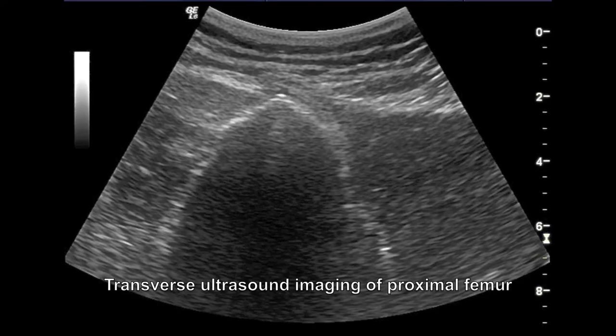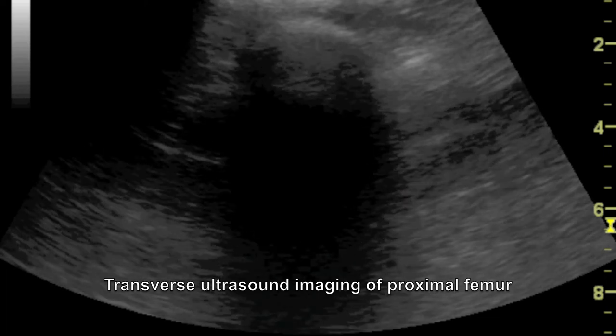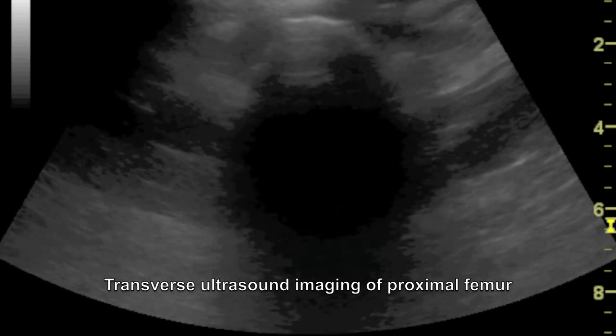The ultrasound probe is initially oriented transverse to localize the greater trochanteric tip and to assess the orientation of the proximal femur should deformity be present.